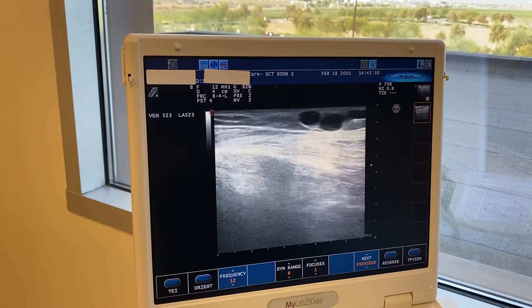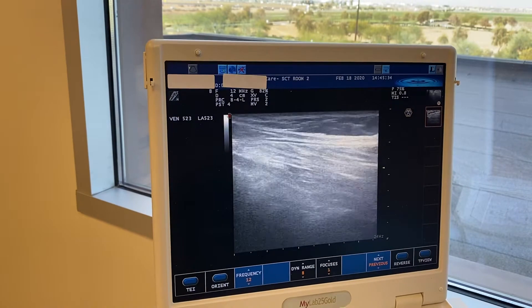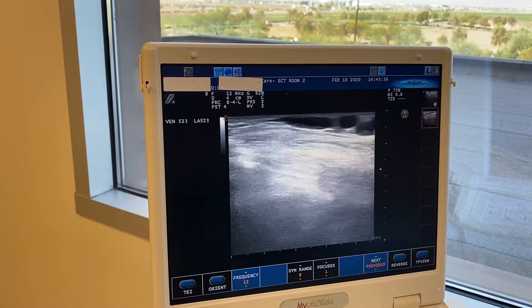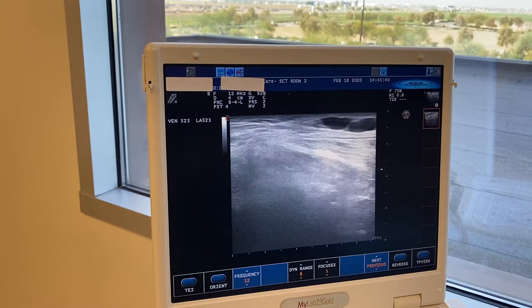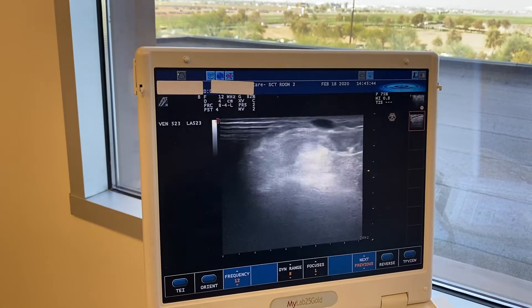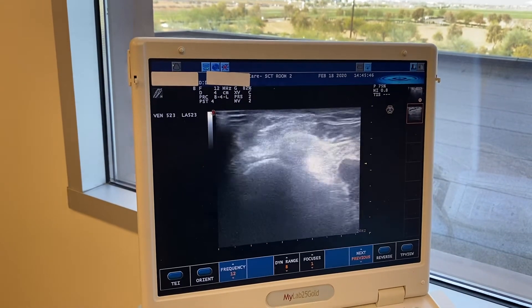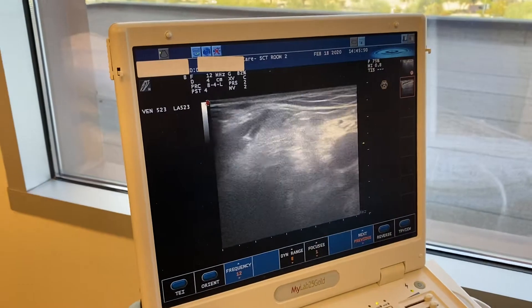Looking at the profile here, you'll see there's just a very small, short segment before it goes into the popliteal vein. Let me find it here for you — let's see where it joins the popliteal vein, right there.